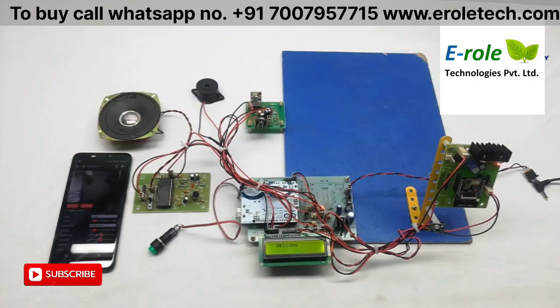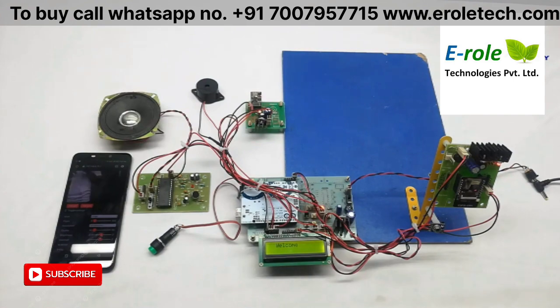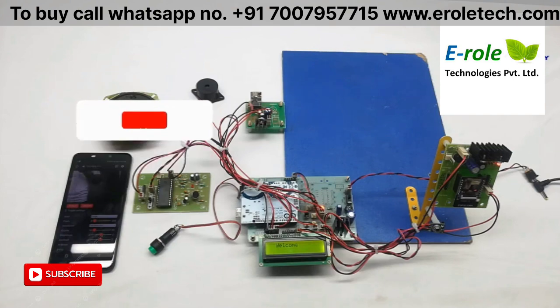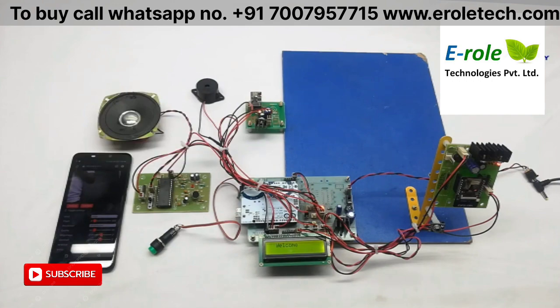Now coming to the project operation, here we have to show our face with or without mask in front of the camera and press this button. If mask is worn, then it starts scanning the temperature. If temperature is less than 100 degrees, then audio will come as "you can go." If mask is not worn or temperature is more than 100 degrees, then audio will come as "will not allow." And also the temperature and face mask information will be uploaded to the IoT server. Now we have to log in.